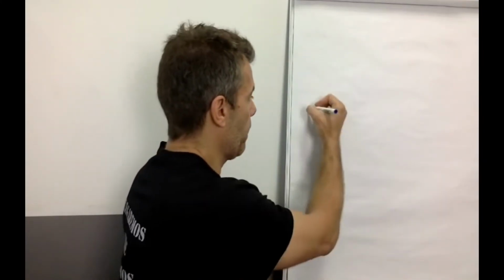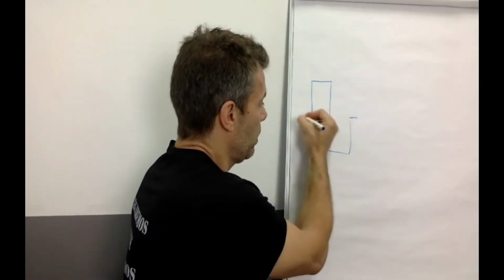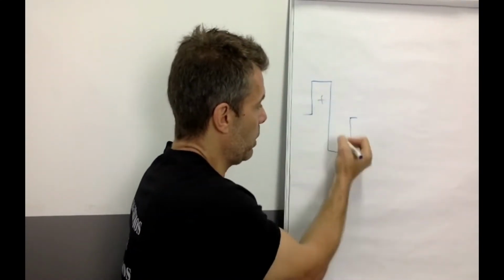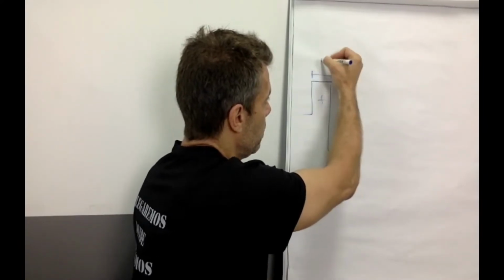First, it's very, very important to understand that TENS is an analgesic program. Okay? So that program is not going to help contract the muscle to gain strength to achieve hypertrophy, whatever your muscle goal is. Okay? Because they stimulate different fibers. TENS stimulates a fiber called A beta, and it has a very short stimulation time. Just look. This will be the impulse with the positive and negative parts, and this is the time. Okay, the stimulation time for that fiber.